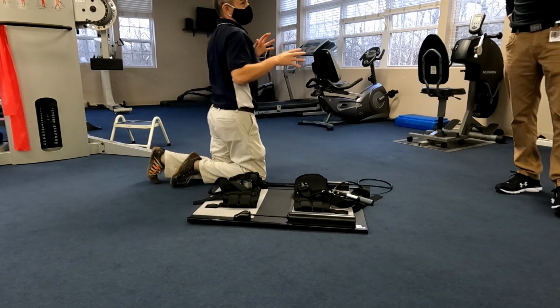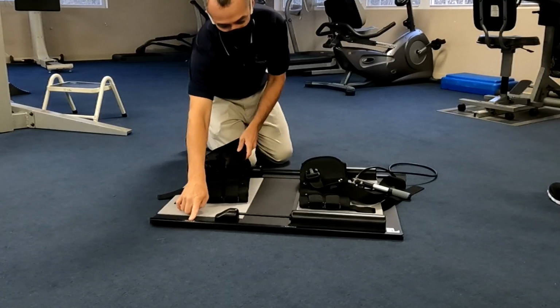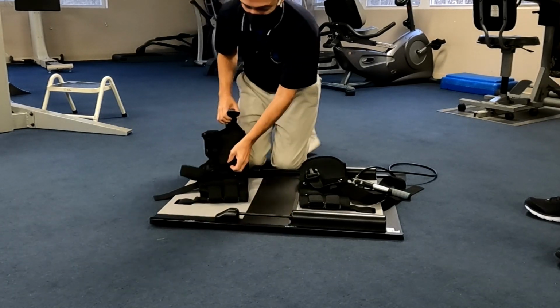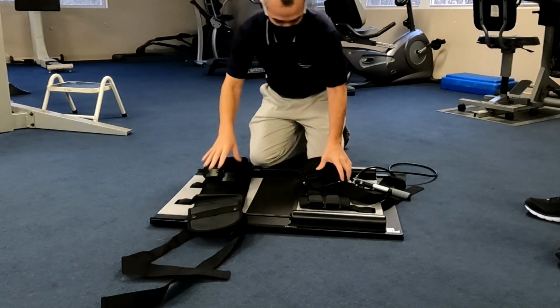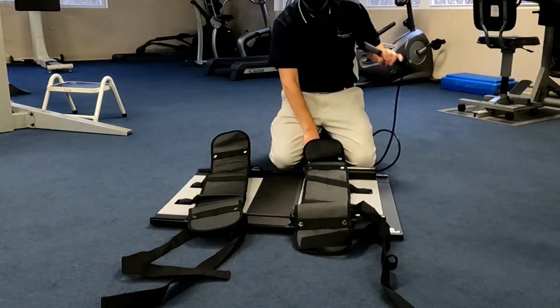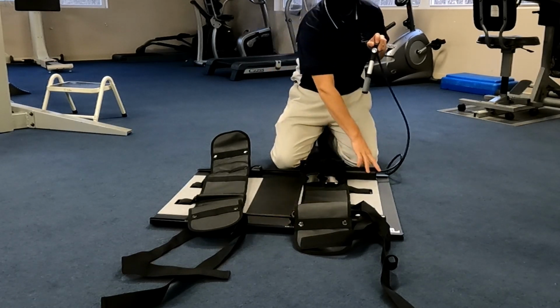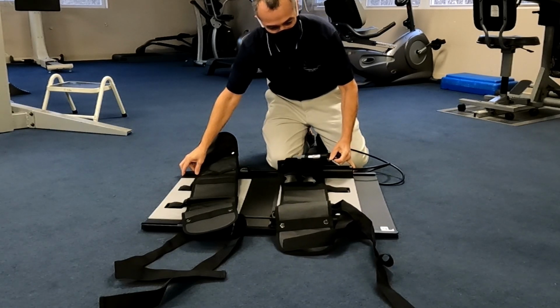So I'll explain it to you first, how it's gonna work. Basically, what we've got is the upper and the lower. We'll open the straps up, lay everything out. This is the pump. Yep. If I push the button, this will slide in to release the pressure.